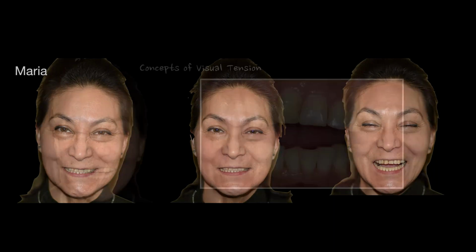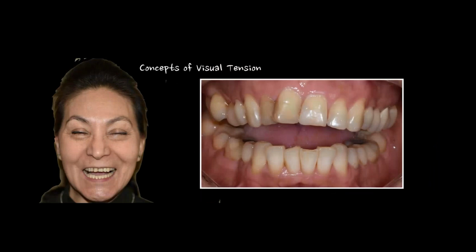So you can see that there's a lot of visual tension here and a lot of disharmony here. And in truth, this is not an easy fix because there's not a lot we can do unless we really think of a different path. And in this case, the path was an orthodontic movement. So rather than try to fix all of this from a crown and bridge point of view, we all felt that it was best to do some orthodontic movements.